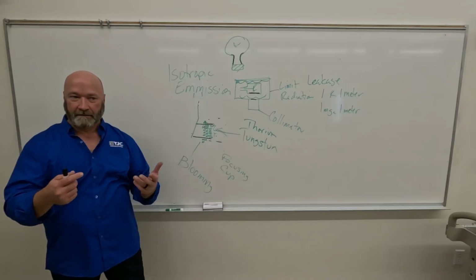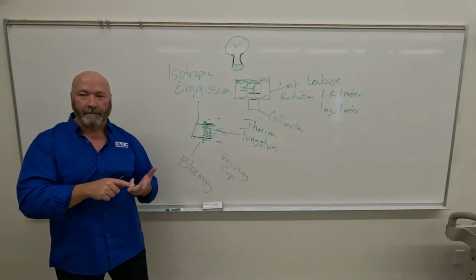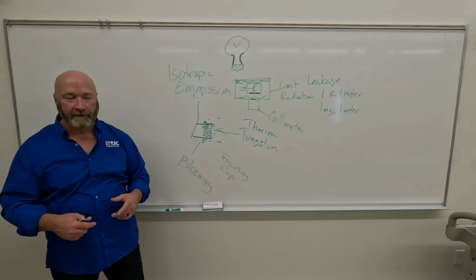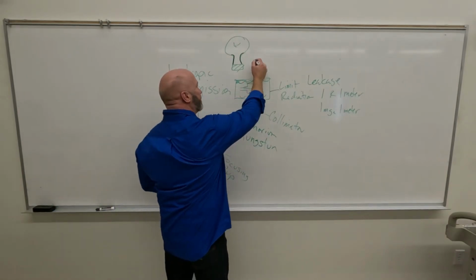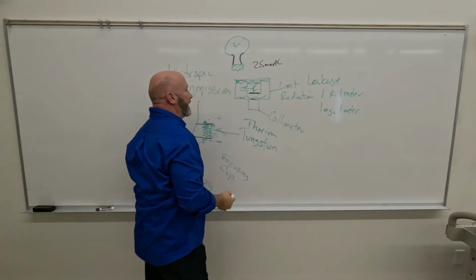And there's two components of that. We can't take it out, and we have to have that much in order to legally make an x-ray. And that amount is 2.5 millimeters of aluminum equivalent, okay? So with tube life, let's say a brand new x-ray tube comes up to 2.5 millimeters of aluminum, because that's what we have to have.